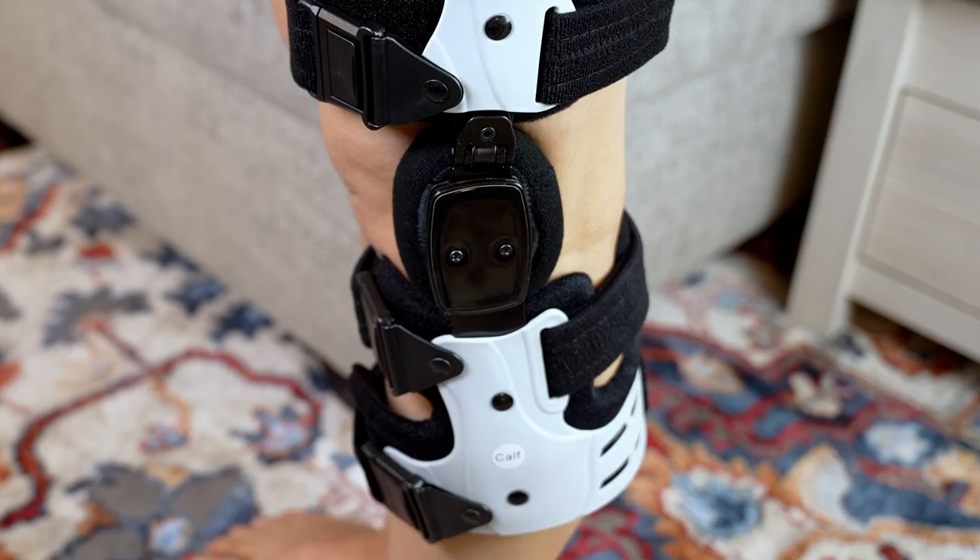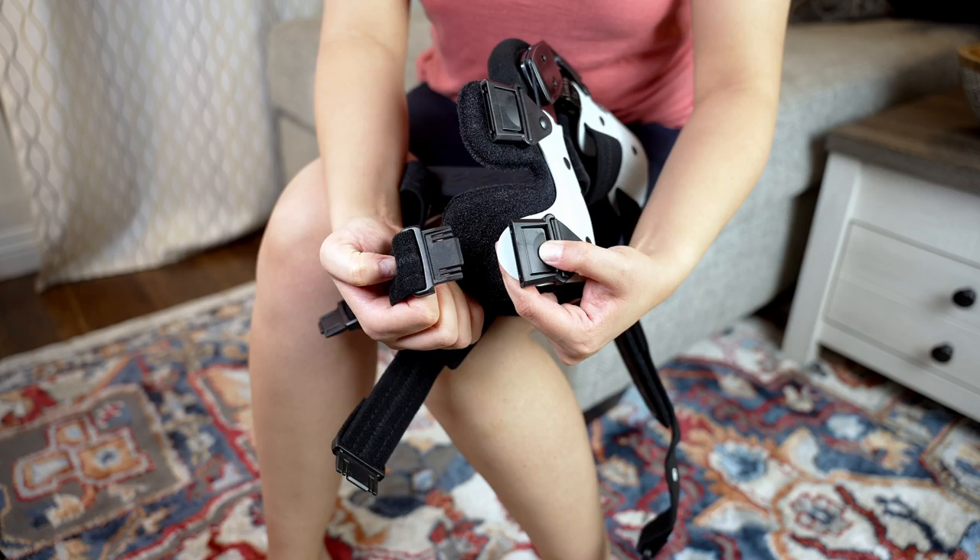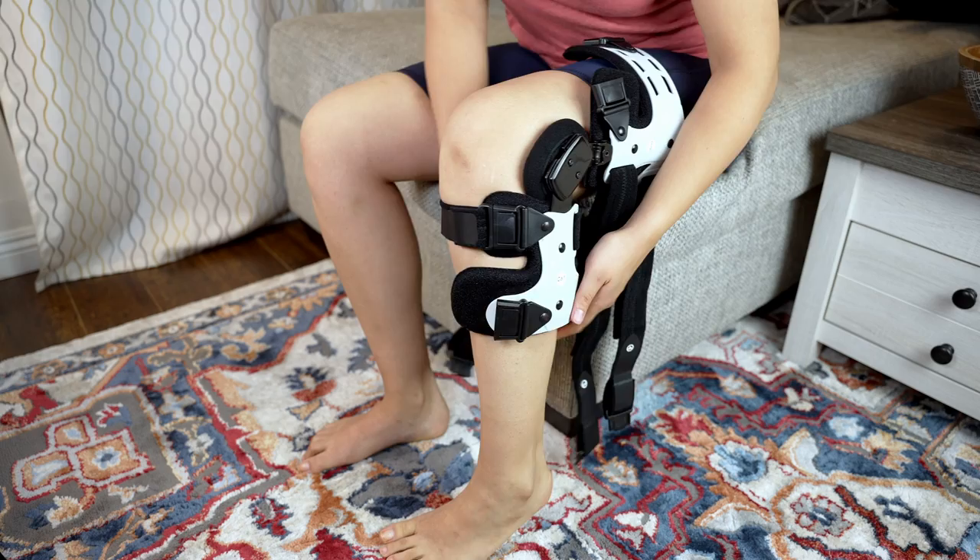Let me show you how to put it on. First, loosen the straps for the first time use and detach all of the buckles. Then put the brace on your leg and fasten strap number one around your kneecap, then the second, third, and fourth strap.